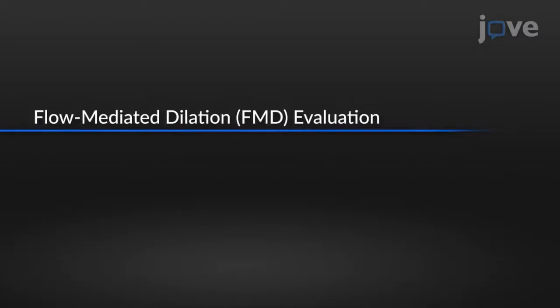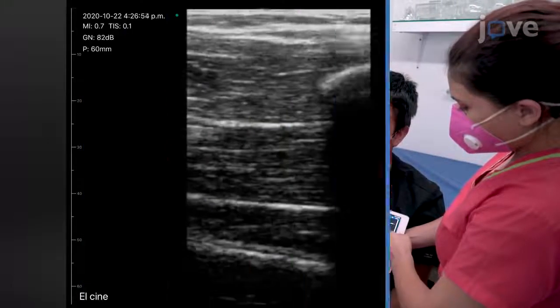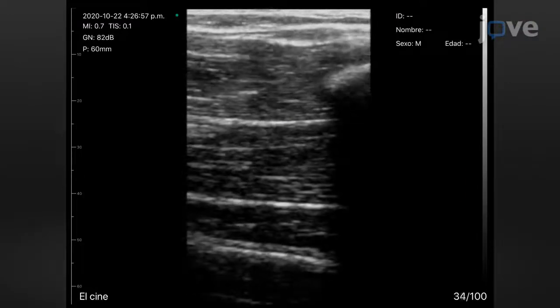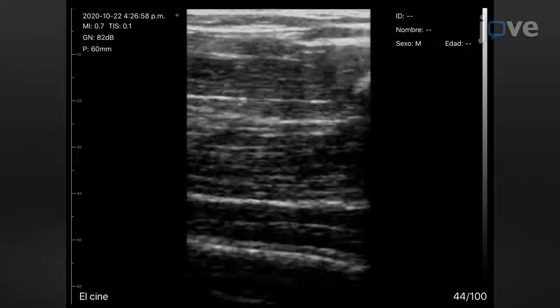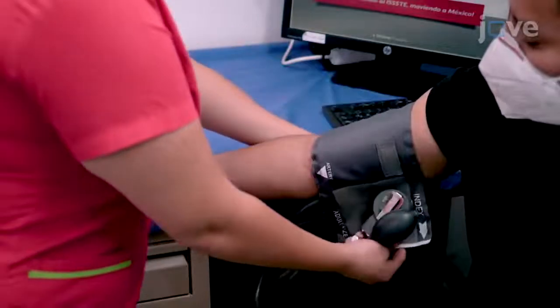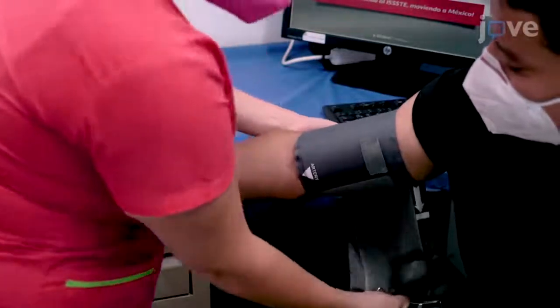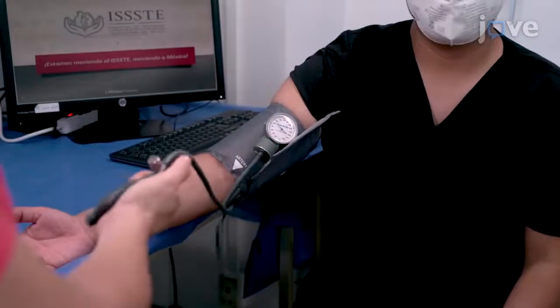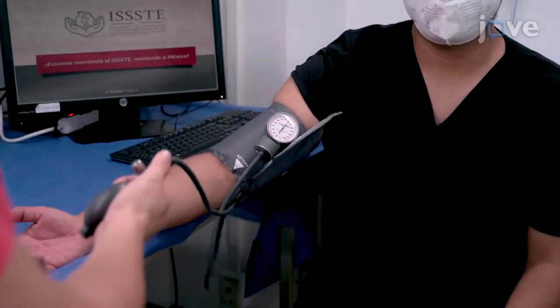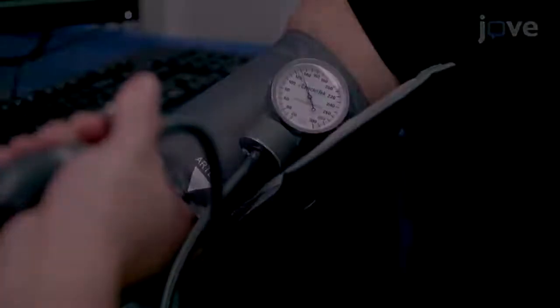To determine the pre and post angioplasty FMD, use a vascular linear transducer to measure the diameter of the brachial artery of the patient. Next, place the cuff of a sphygmomanometer above the measurement site in the forearm, and insufflate the cuff 50 mmHg above the systolic blood pressure for 5 minutes before deflating.